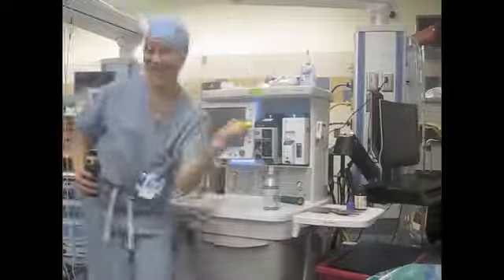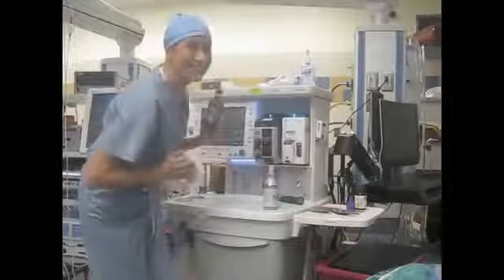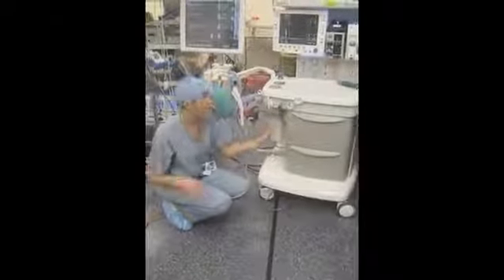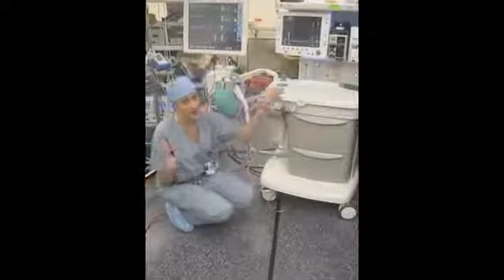Fill the vapes with a matching key and med in hand. Fill it till you reach the top line. Clear CO2. The more you know your machine, the safer you are in your practice bottom line. And the sooner you go home and drink wine.